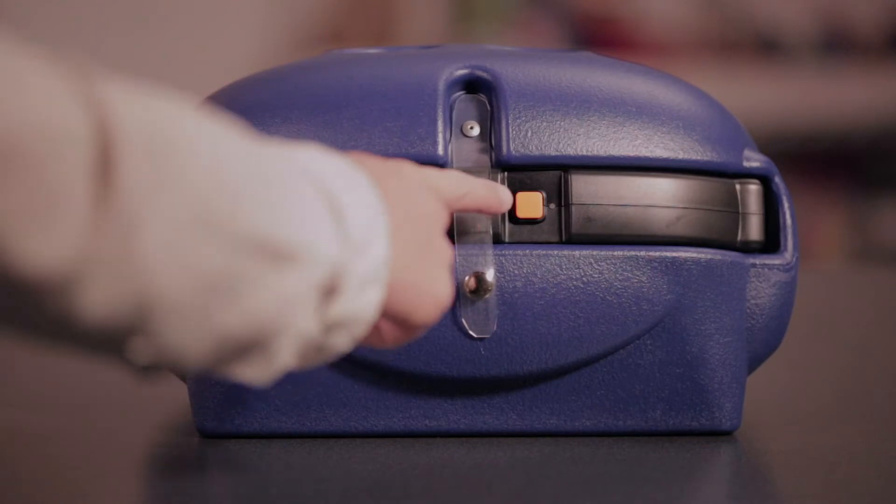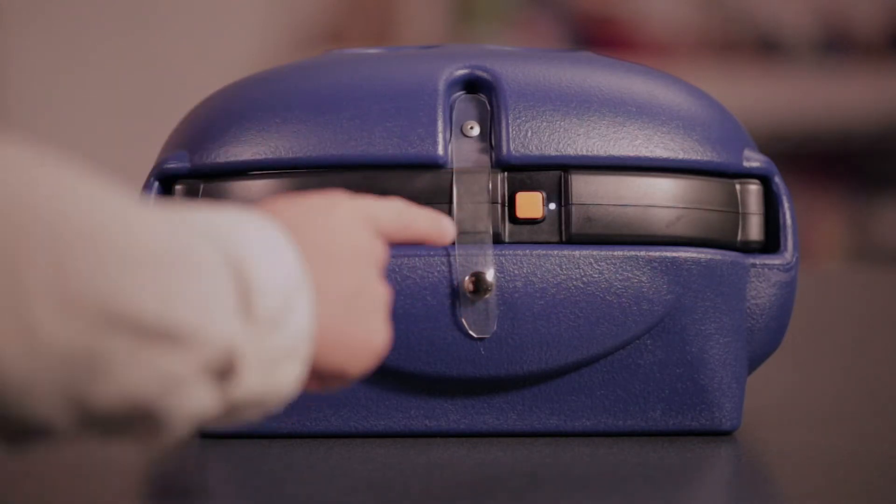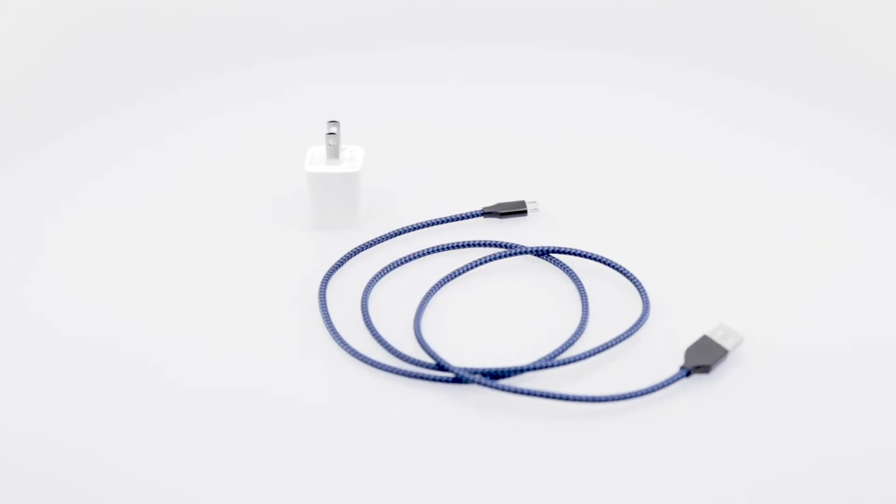The glow bar LED power indicator also displays the battery charge state. When the indicator turns red, it's time to recharge. USB power supply and micro USB cable are included.